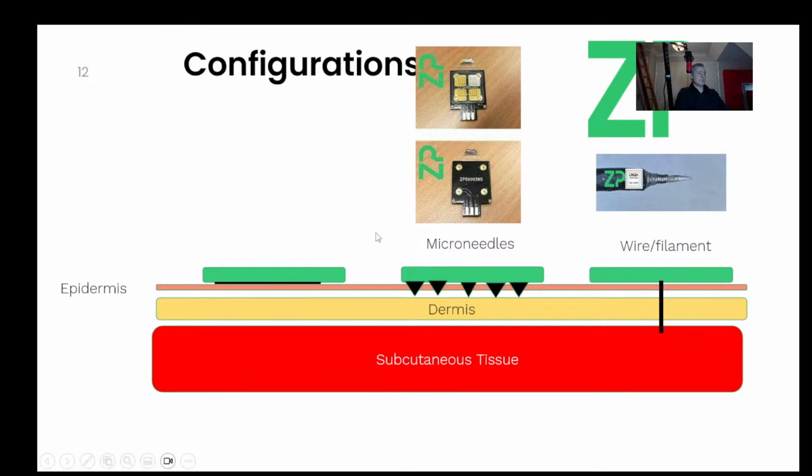First of all, I think it flies in the face of the FDA. I think it is in the FDA statement that if you're not breaking the skin, they didn't say you've no chance of accuracy, but they're sort of saying they're not very supportive of it. So I'm not going to go into the sweat, though we are capable, and we're also doing implanted as well, and I will discuss that today.